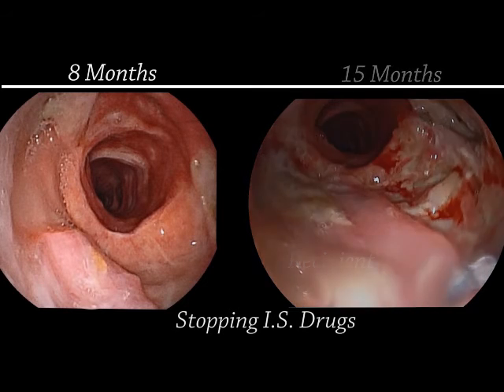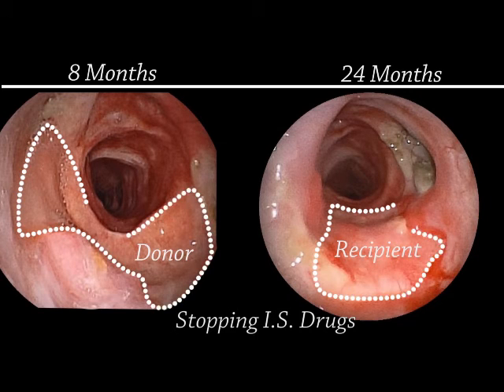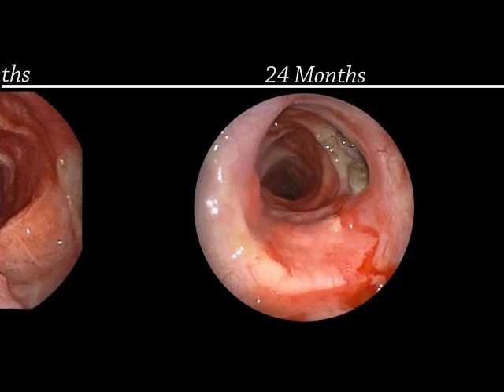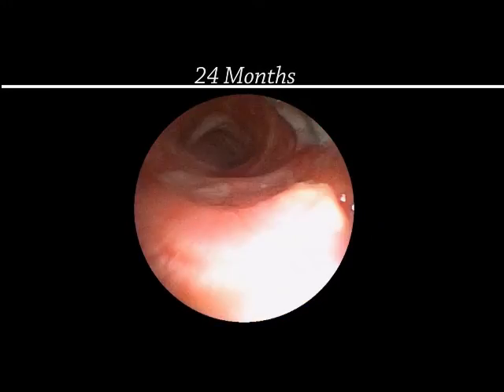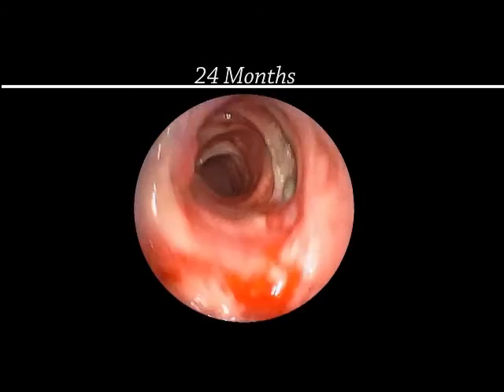The endoscopy 2 years after orthotopic transplantation and 1 year after stopping immunosuppressive drugs shows a fully healed transplant. The site of the recipient's mucosal lining has enlarged compared to the situation during withdrawal of immunosuppressive therapy. The airway lumen is reduced at the sites of the rejected donor mucosal lining. 2 years after orthotopical transplantation, the reconstructed airway is stable and safe.